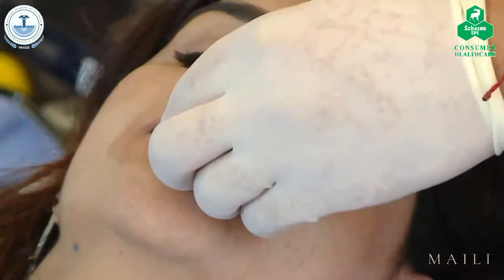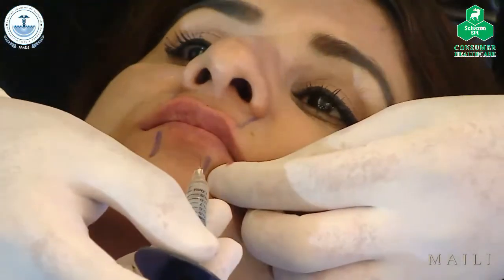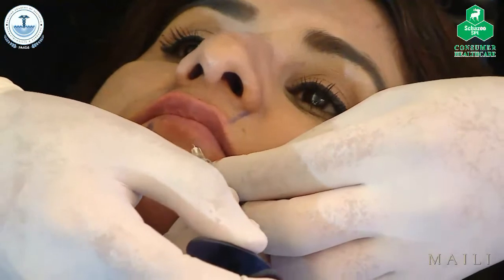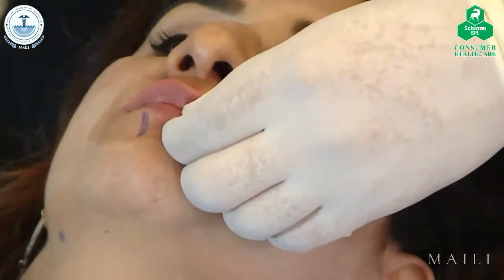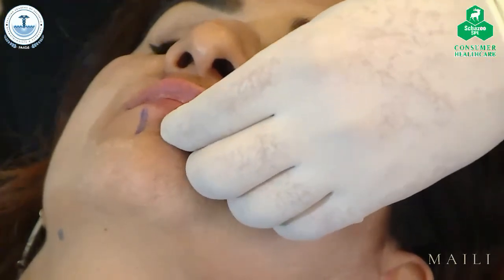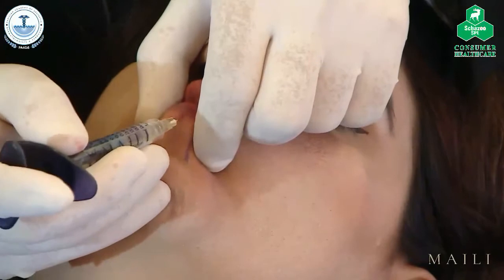It's all about placing it over the muscle, not too superficial, but not too deep. Same thing. And when you say superficial or too deep, it's in the muscle. Just over the muscle. I try placing it. Can you find a place over the muscle? No, I try. I can't.